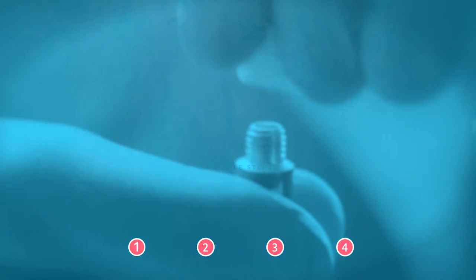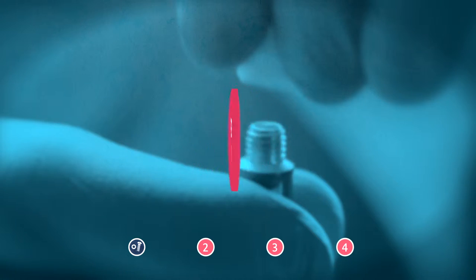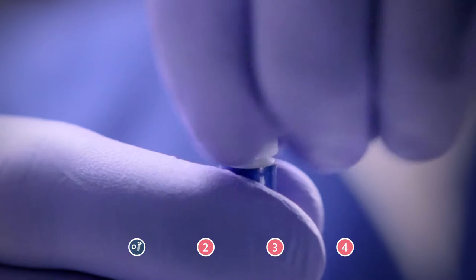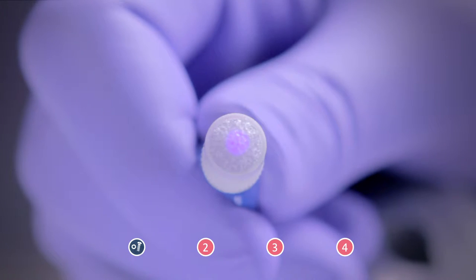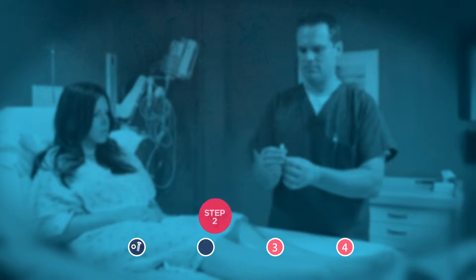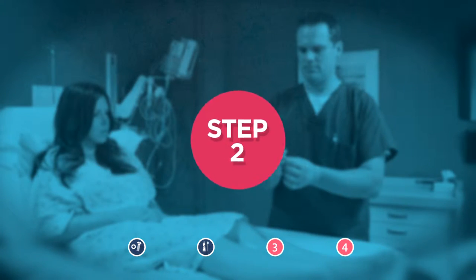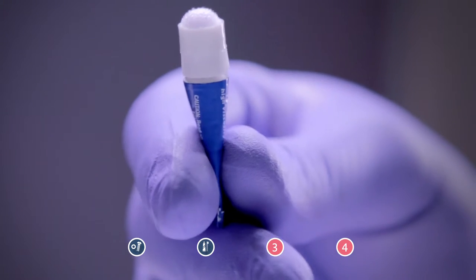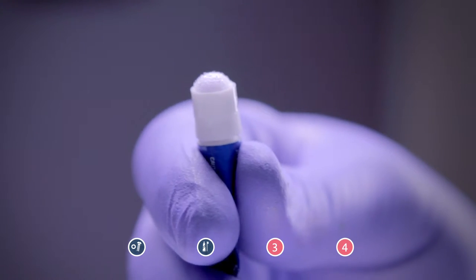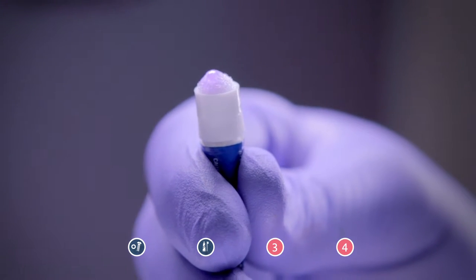Just like putting a nut on a bolt, you simply screw on the broad surface applicator tip until the protective seal is punctured. You will notice that a purple dot appears on the applicator sponge after the seal has been punctured. While holding the device upright, do what mom used to always tell you when squeezing a tube of toothpaste — squeeze from the bottom. Continue to flatten the tube, moving all adhesive to the top until a steady flow is expressed through the applicator sponge.